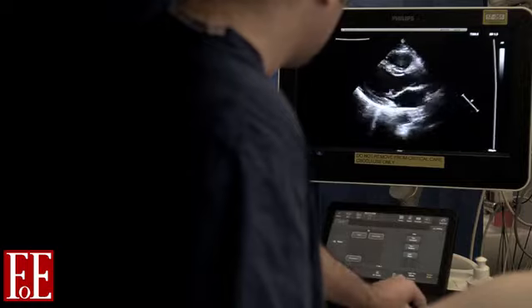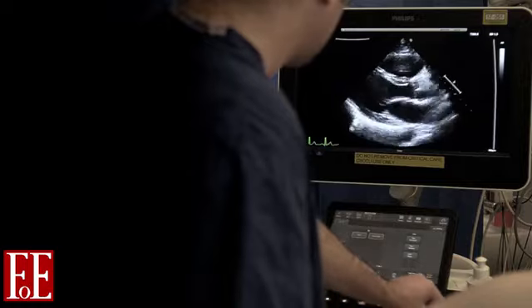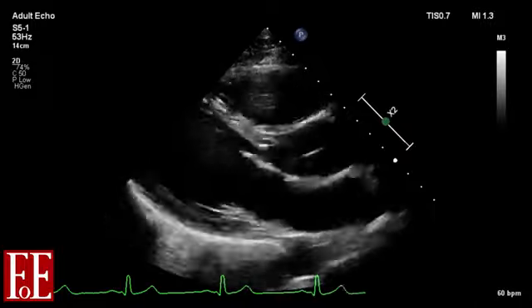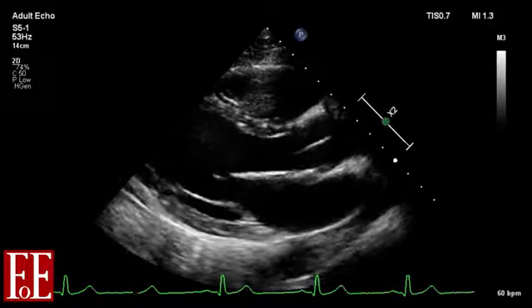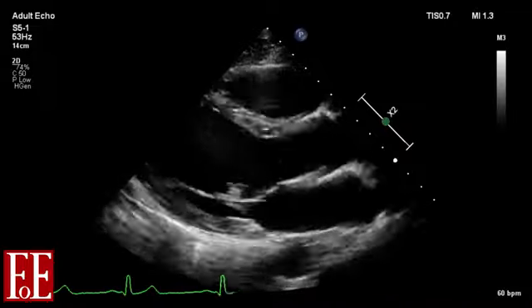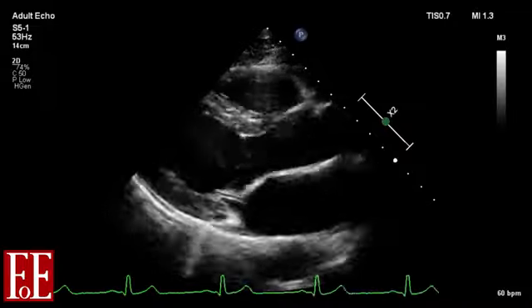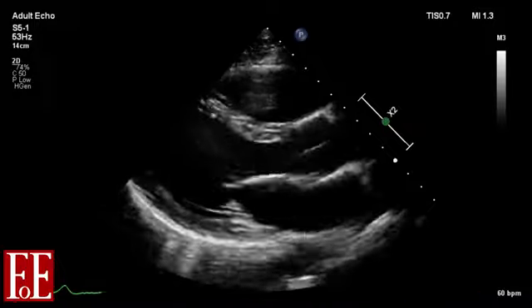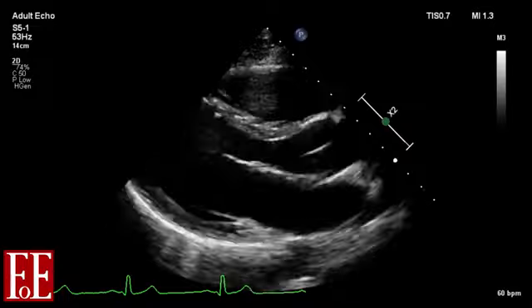From our deep parasternal long axis, we're going to decrease our depth and come up to a cardiac focused image. So now we're going to decrease the depth to 14 centimetres so that we can still see a little bit of the descending aorta. We make sure that all the pericardium is in view, we've not cut off any of the left atrium. We're going to raise the focus point, bring it up into the near field so it's at the level of the aortic valve.